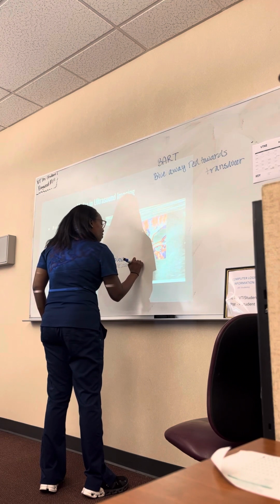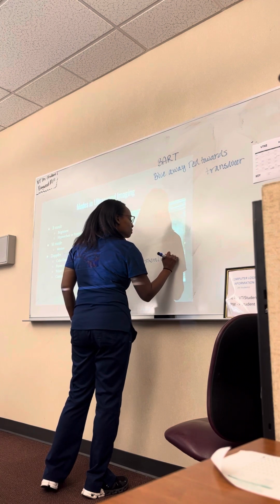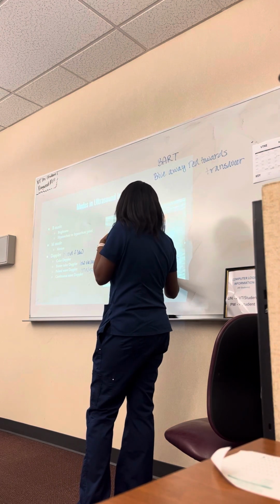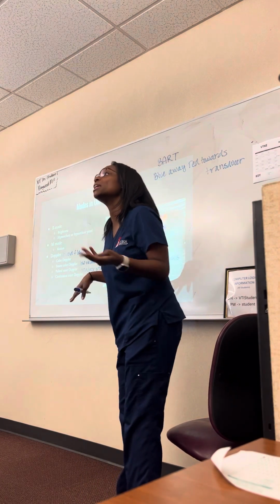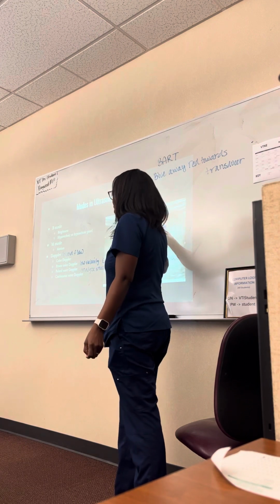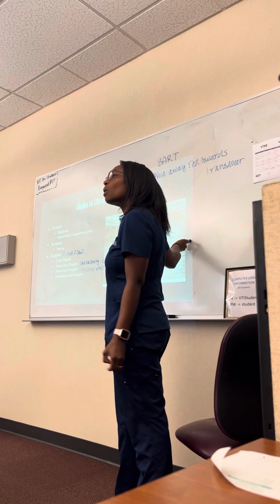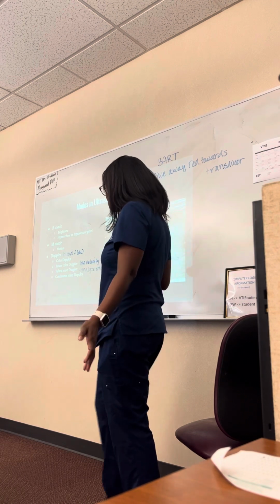The reason why this comes in handy is that I'm able to see if maybe there's an occlusion somewhere, or a blockage, or something along those lines. I can put this pulse wave Doppler setting on those vessels and say, okay, something's going on here. This isn't right. This is occluded in some way. All right.